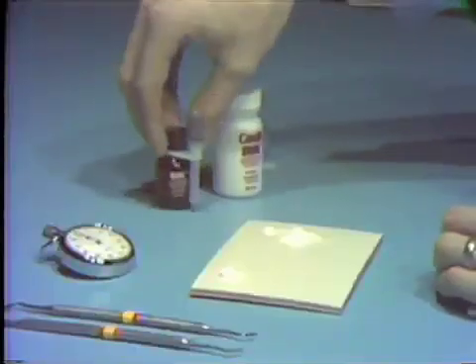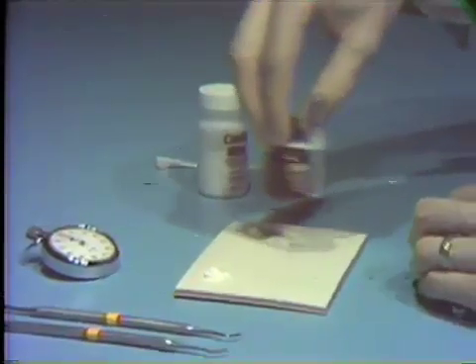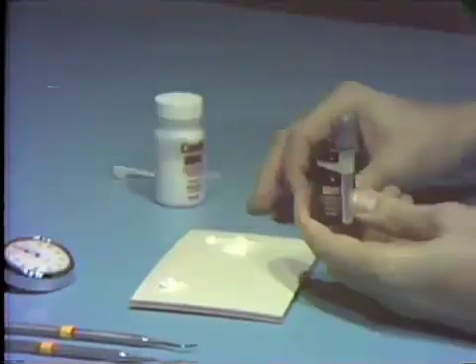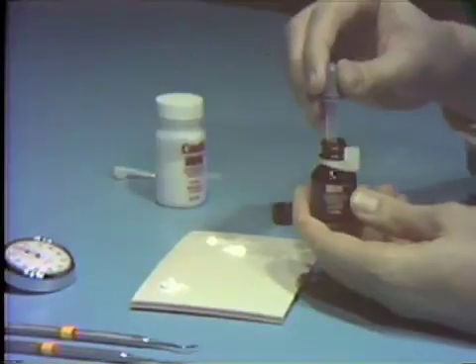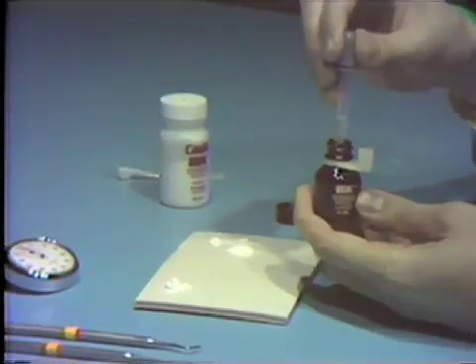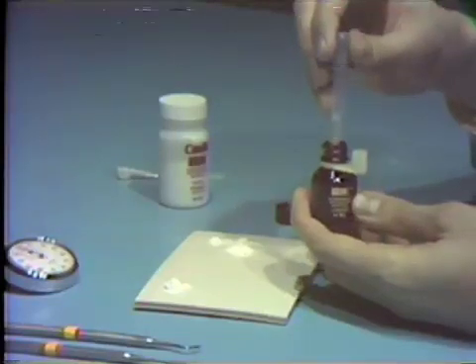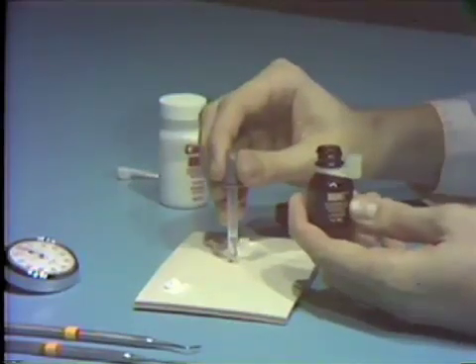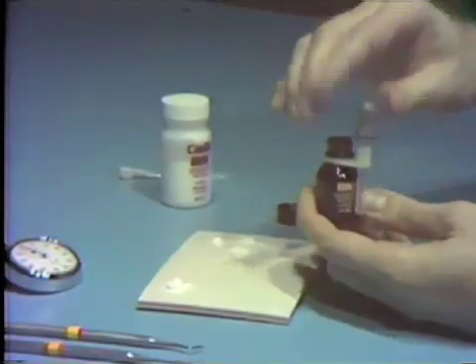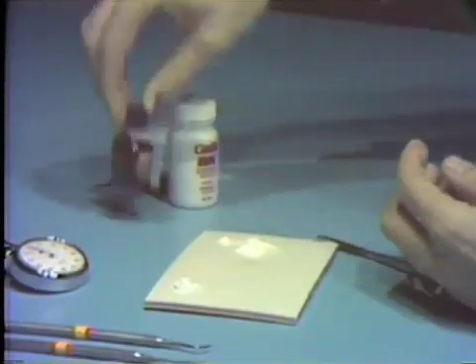The liquid is then prepared by swirling within the liquid container to ensure uniformity of composition. The dropper is used to obtain material, with the first drop dispensed back into the container. Two drops are then dispensed onto the mixing pad adjacent to the largest increment of powder, the dropper being held perpendicular to the pad to ensure uniformity of drop size.